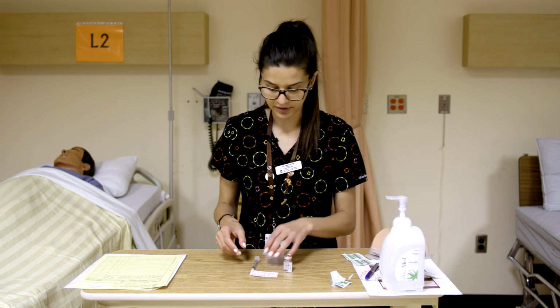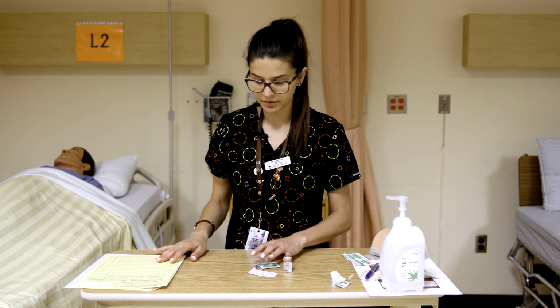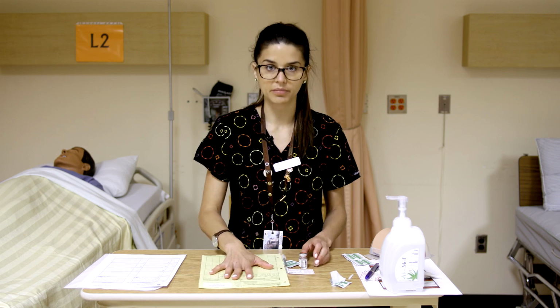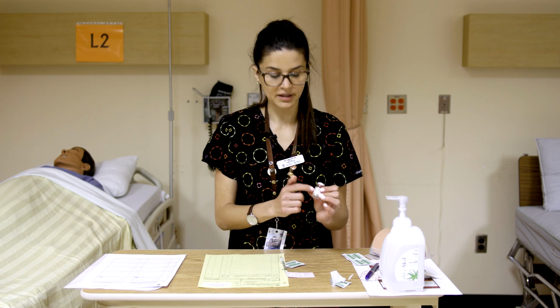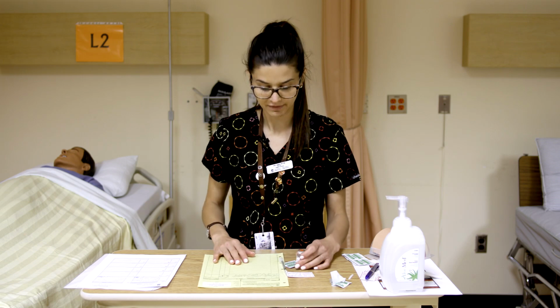We're going to get an alcohol swab ready to bring with us to our patient. But before we leave, we're going to want to do a second check. So you're doing your second check with your MAR, with your medication label, with your syringe and amount, and with the container you took it from. So it's a couple of things that you need to actually check and verify.